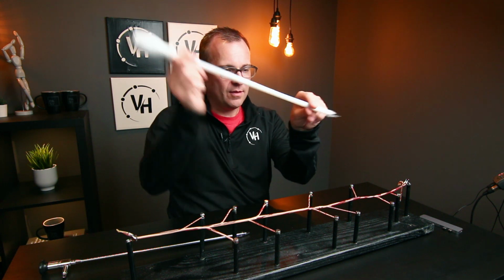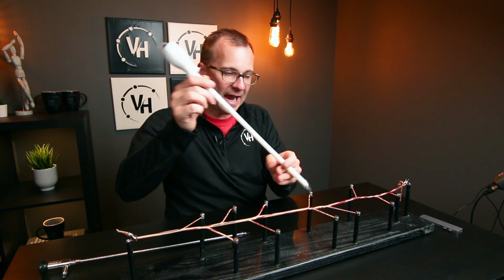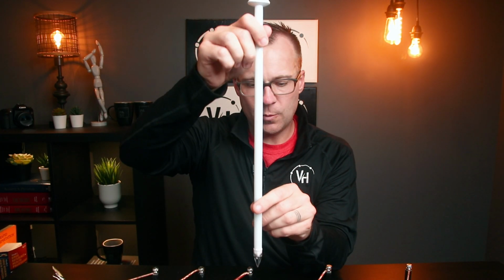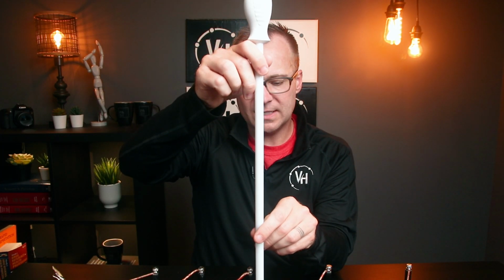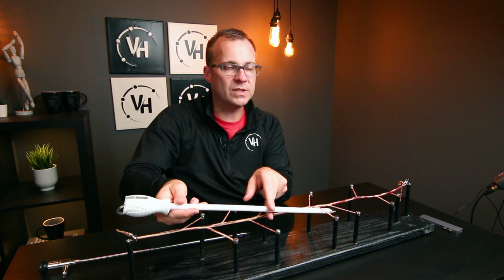So we don't want to find the vessel all the way up here and then start to work backwards or anything like that. I mean, it's possible. In theory, you could do it, but we want to get that scope right down onto the saphenous. Oh, here's my saphenous. I'm going to drop that down and I'm going to start my posterior dissection.